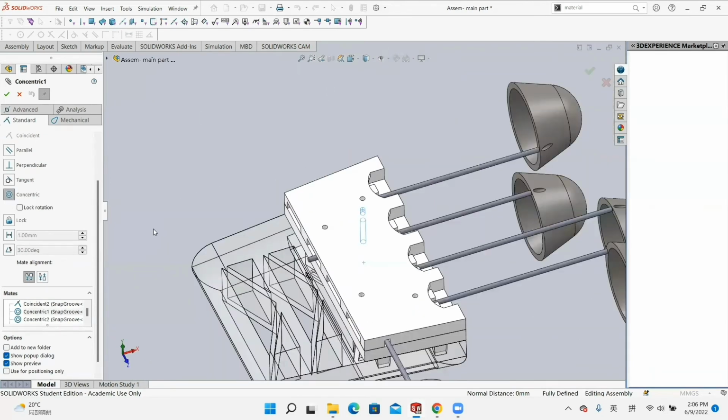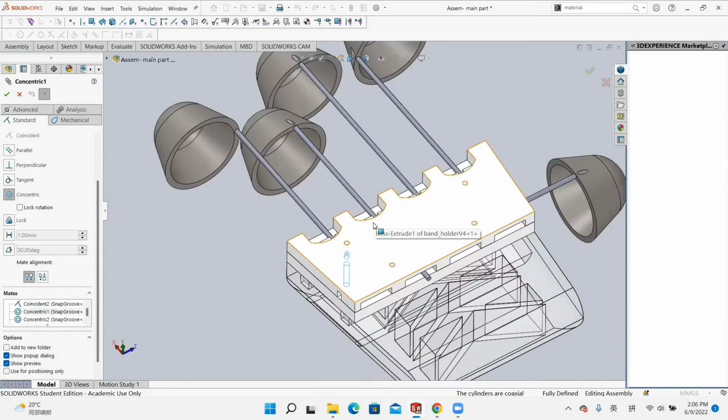The snap grooves has 2 holes for the screws, and the snap hooks part has corresponding holes for the screws. So we use 2 concentric mates, choosing the inner cylindrical face of the holes on the snap grooves and the snap hooks separately to make these 2 parts perfectly fitting. Make the holes for the screws concentric to each other. So we do the concentric mate for both holes.